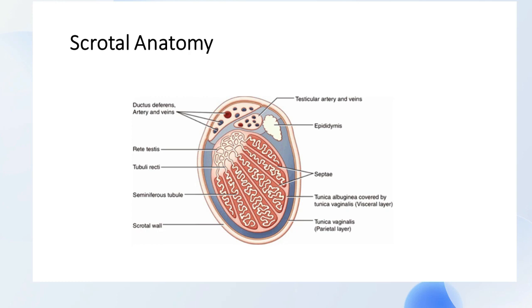You can also see blood here in case of trauma. You can also see pus collecting here in case of pyoceles. So this is a very critical space that you must always make sure that you analyze so that you don't miss critical pathology. Also, you must know that in this potential space, there is also some mild free fluid for lubrication purposes, so it is more physiological in nature than pathological.